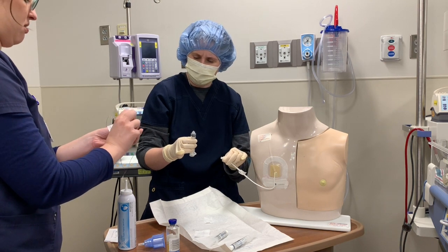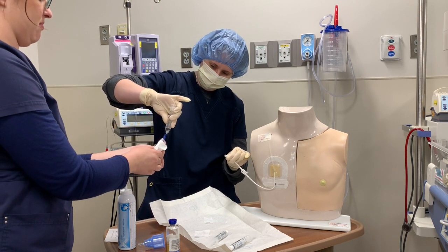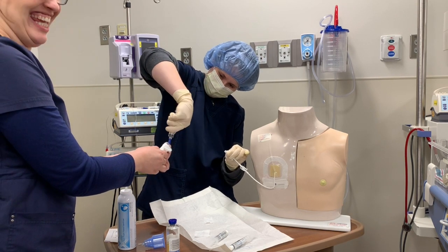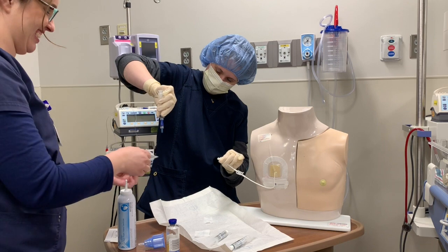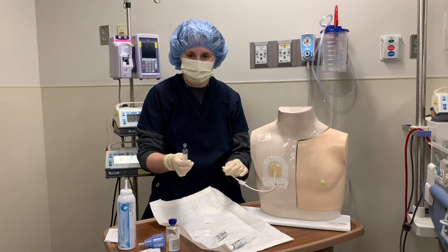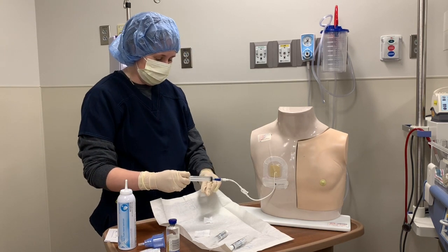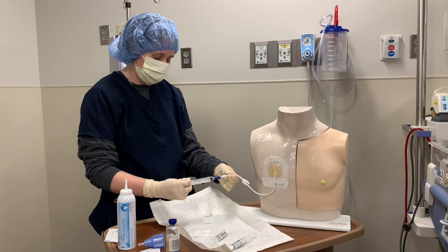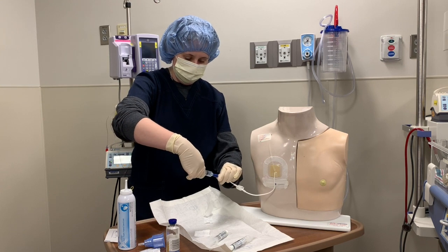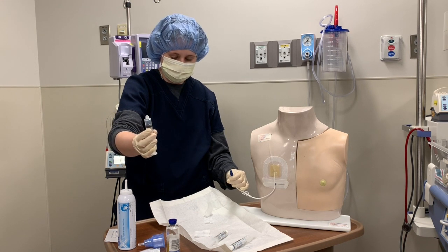She helped connect the new clave to the syringe. This is unprimed, and then you're going to connect it right here — this is how you pull your specimen. I can drop this gauze now, unclamp, and pull my specimen out — this would be blood pulling out. If I have my helper nearby, I can hand them the specimen until I'm ready to transfer, to reduce the chance of contamination.